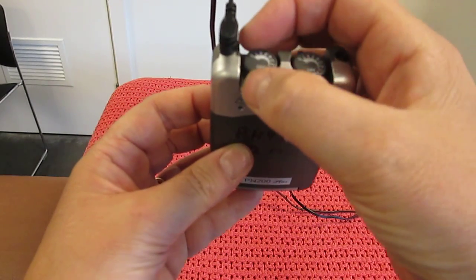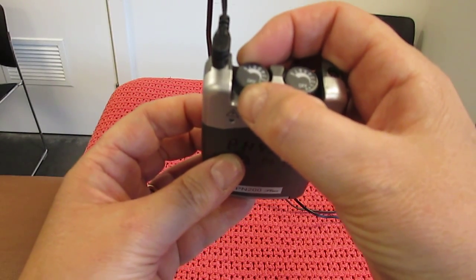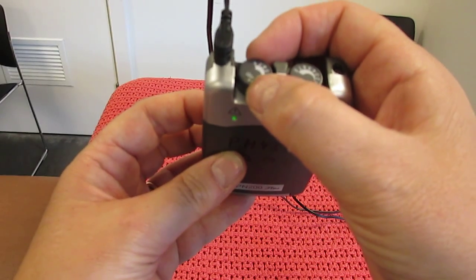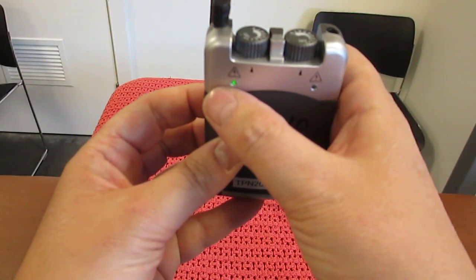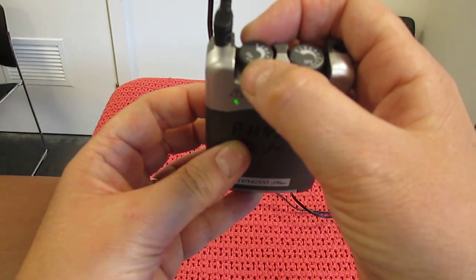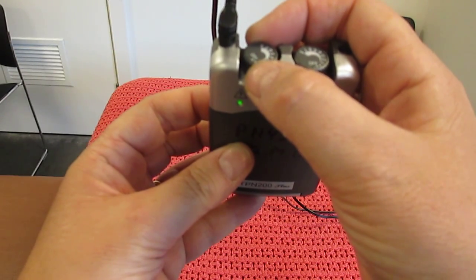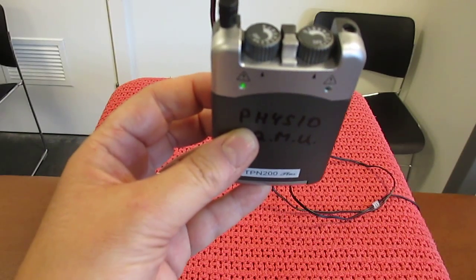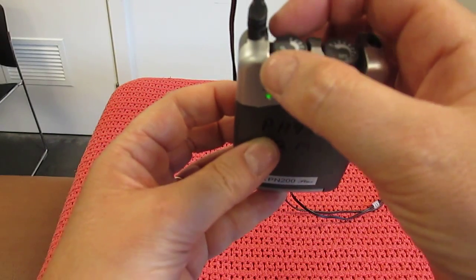listening for the click on and up. You would see the green light flashing, and you'd turn that slowly, asking the patient to report back when they feel a strong but comfortable sensation.